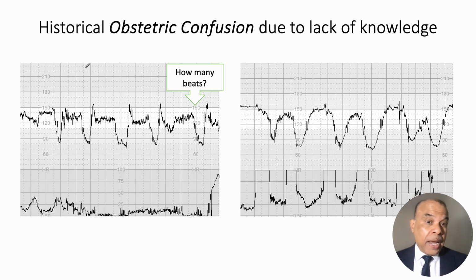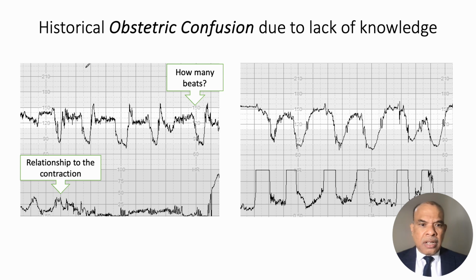So if you go back to our historical confusion, we failed to realize the physiology, that these are protective responses. So most guidelines call them various names and panicked and did interventions. It's like fetal blood sampling, scratching the baby's head, fetal scalp stimulation, or cesarean section, or vacuum or forceps, because of lack of understanding of what these meant. Whatever is physiological was considered as pathological.